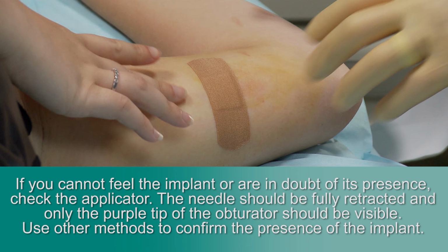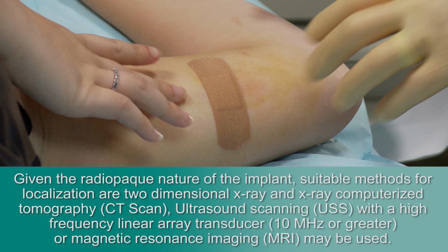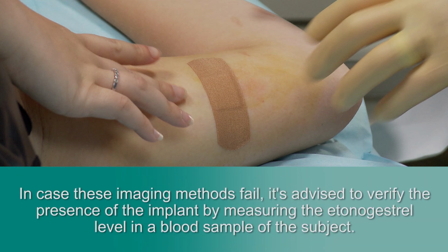If you cannot feel the implant or are in doubt of its presence, check the applicator. The needle should be fully retracted and only the purple tip of the obturator should be visible. Use other methods to confirm the presence of the implant. Given the radiopaque nature of the implant, suitable methods for localization are two-dimensional X-ray and X-ray computerized tomography (CT scan), ultrasound scanning (USS) with a high-frequency linear array transducer, 10 MHz or greater, or magnetic resonance imaging (MRI). In case these imaging methods fail, it's advised to verify the presence of the implant by measuring the etonogestrel level in a blood sample of the subject.